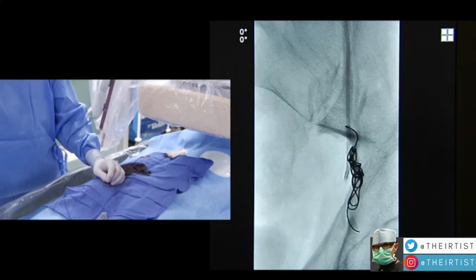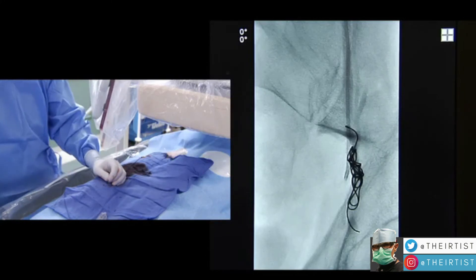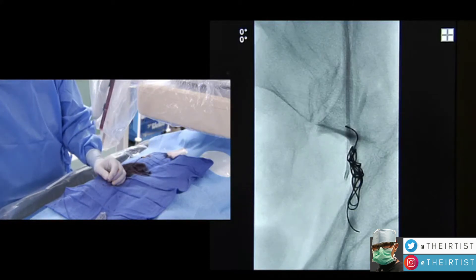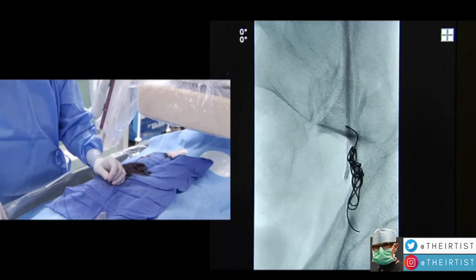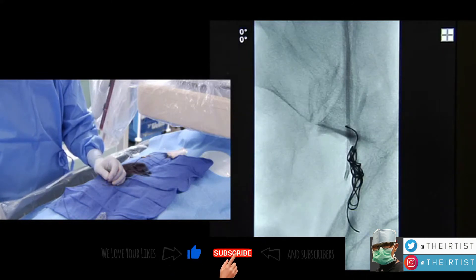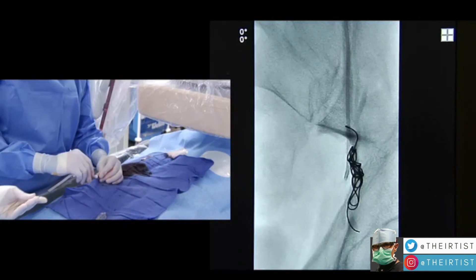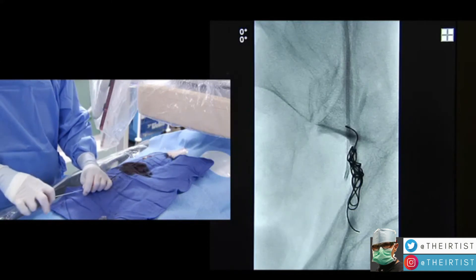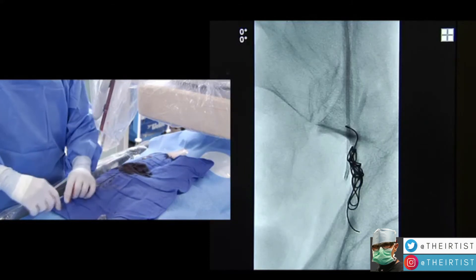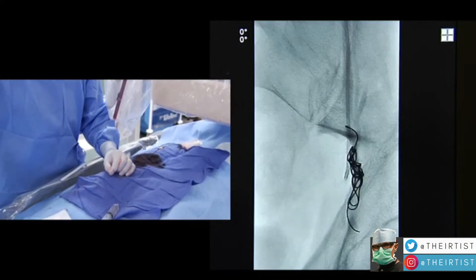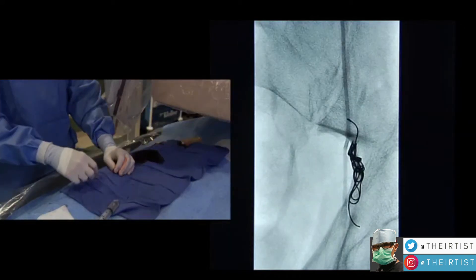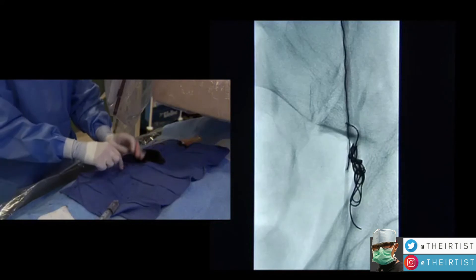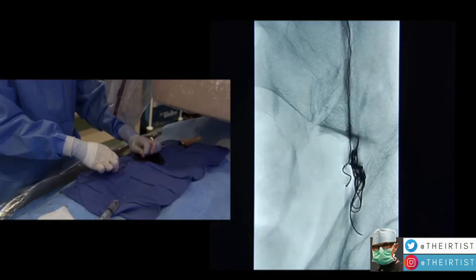This is the sandwich technique: coils are placed distally, and above the coils a sclerosing foam agent is placed using liquid sclerotherapy. Some physicians have even used boiling contrast to treat the vein. The goal is to prevent any material from leaking down to the testicle. Manual compression of the vein at the inguinal ligament by an assistant makes this procedure very safe — ensuring zero chance of the sclerosing foam reaching the pampiniform plexus or damaging the testicle.